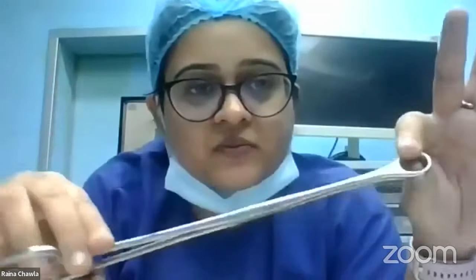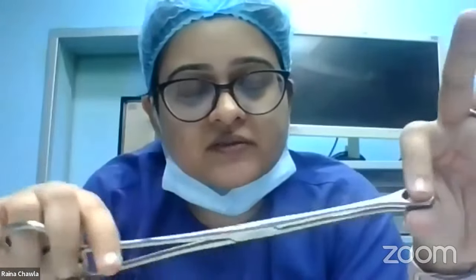This is used in vaginal surgeries also. This is a sponge holding forceps or a ring forceps. It is used to clean the parts of the operative area. So you take a gauze piece in this, soaked in betadine, or whatever antiseptic solution you're using, and you clean the parts.